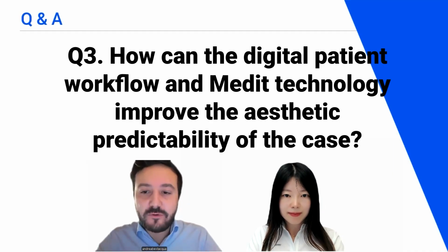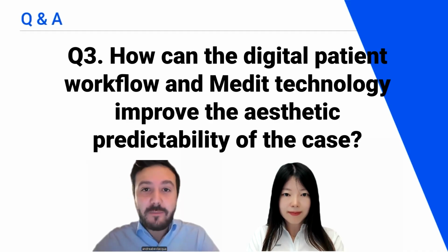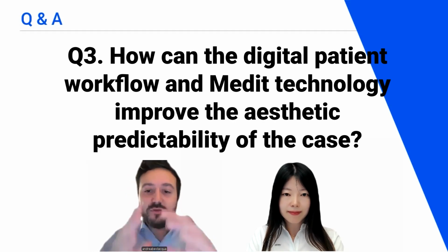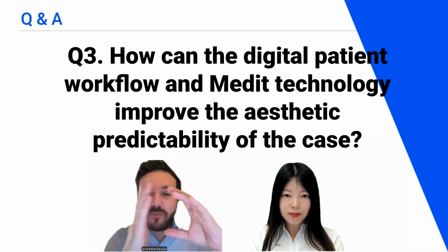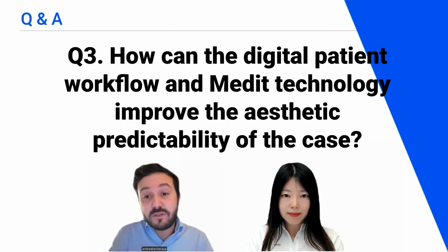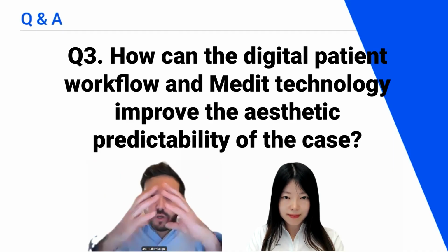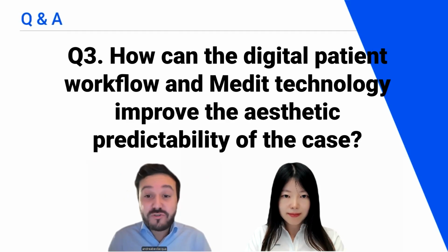you start with the face of the patient, but you can also scan the mock-up before prepping the teeth of the patient. So you have the mock-up, you have the teeth of the patient, and while you are prepping, you have the digital patient that is inside of your software. So you have the Medit Link, but also the Medit Scan, which is the software that lets us scan also the face. So you are doing what you have planned.